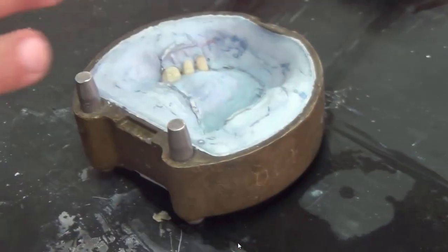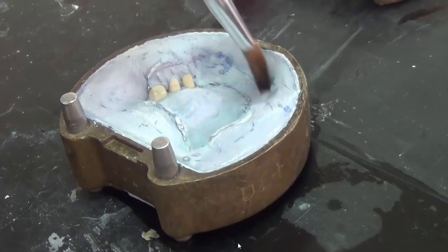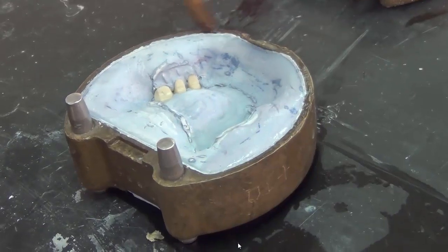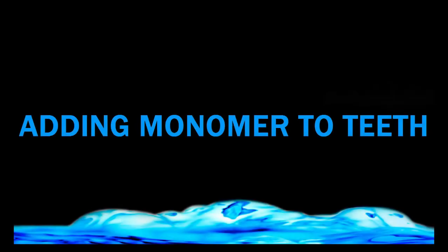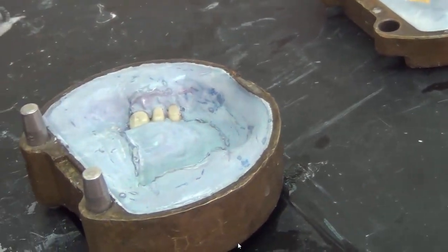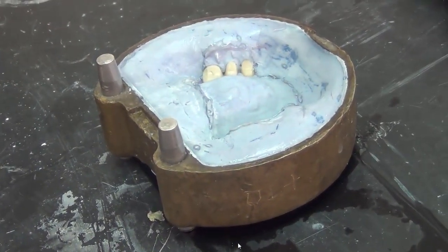Second layer added, and we go to the second layer here. Once more, pay good attention that we don't touch the fitting surface of the teeth. And we will even further clean the teeth later on, before adding in the acrylic. Once the second layer is complete, we come in with a new, clean brush, and if we have anything of the cold mold seal on the teeth, we take it off, and then we paint on the teeth monomer. It's the same monomer in the acrylic mix.